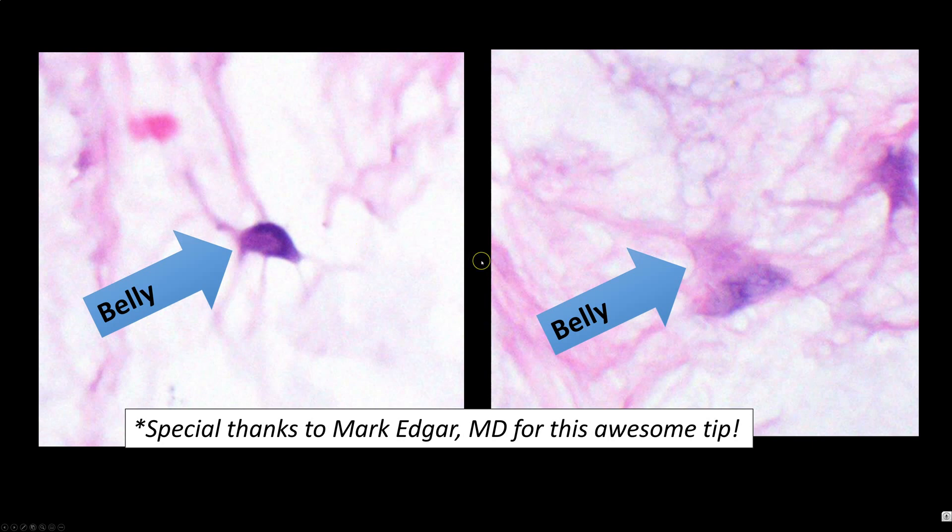That's the 'little fat pot belly' that Mark Edgar taught me about. It's a really cute name for these little pot-belly bean-shaped cells that you tend to see in both cutaneous and intramuscular myxomas — that's the cell I was pointing out.